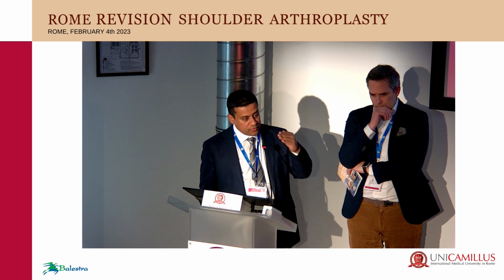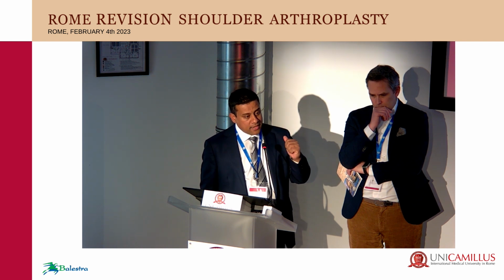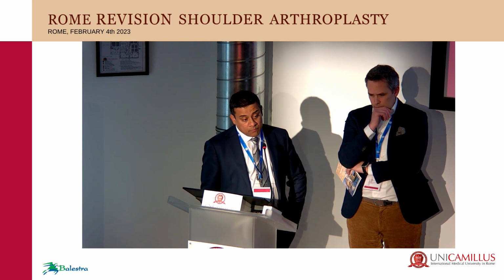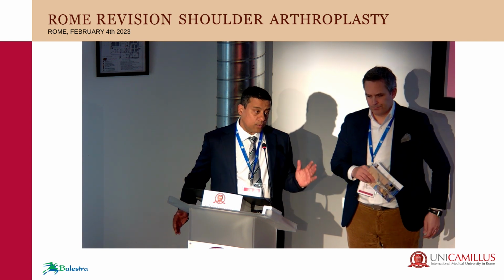And then I curette everything out, and then I put the inserter of the base plate and really try and twist and tap and pull it out. And if it comes out, hallelujah. But if it's not coming out, and the implant's not malpositioned, so that's another big factor, I will leave it.